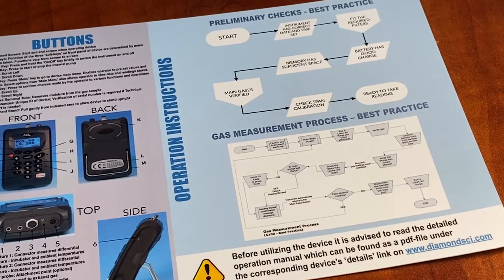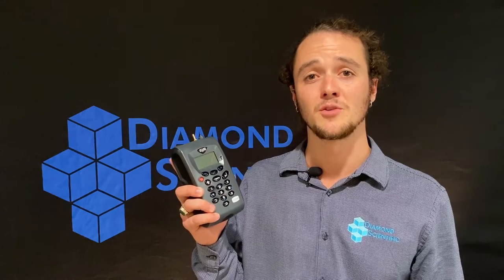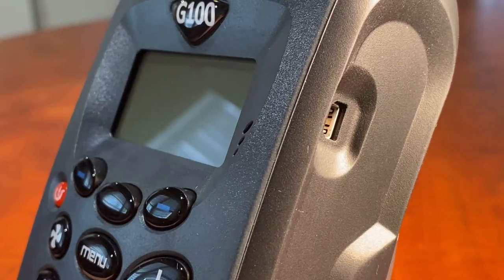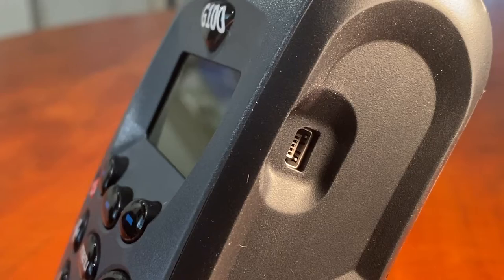The G100 series features built-in moisture removal. In addition to carbon dioxide readings, these units also have the ability to incorporate oxygen measurements, dual temperature probes, and a relative humidity sensor.